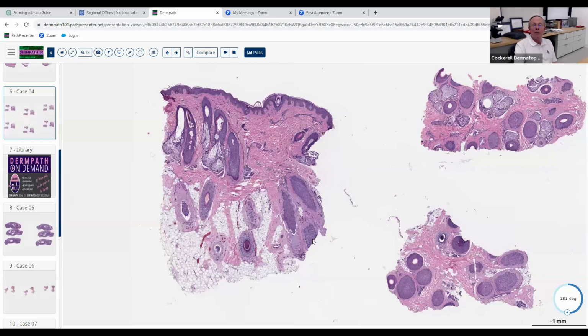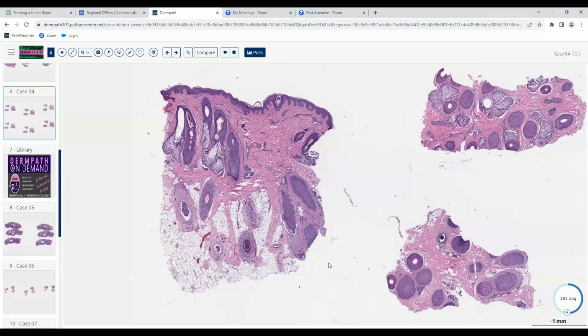This one's maybe in catagen, shifted towards catagen. Here we've got a telogen follicle up here. Things are willy-nilly, but what do you think the scalp is going to look like, given that they have some follicles still sitting in here in anagen? Probably doesn't look like they have much hair because they're not all in growth. Right. They're going to have less hair, but probably not a shiny patch totally devoid of hairs. Some hair shafts are there. So if you look at their overall scalp, it may be kind of moth-eaten, kind of patchy alopecia. It's not going to look like alopecia universalis, for example. Okay, good.